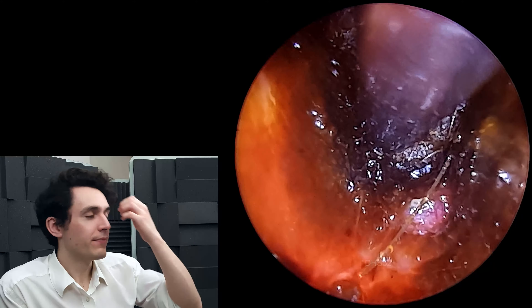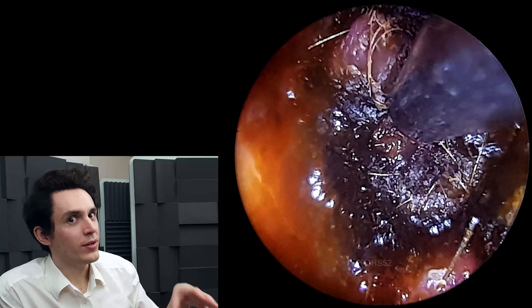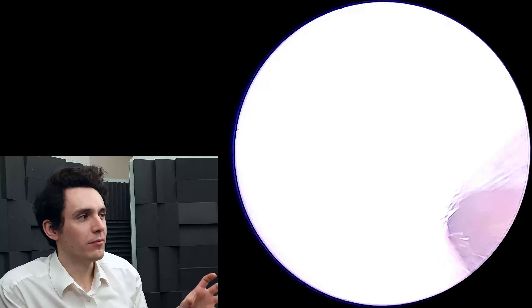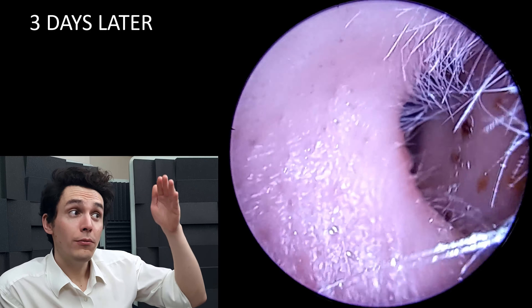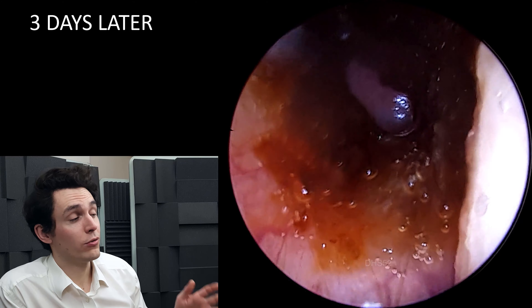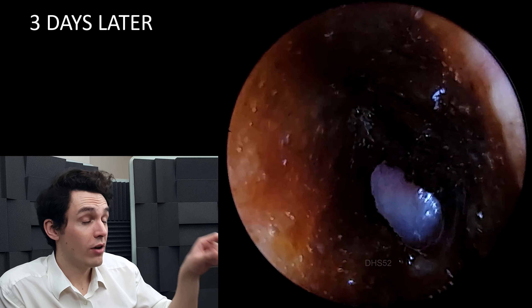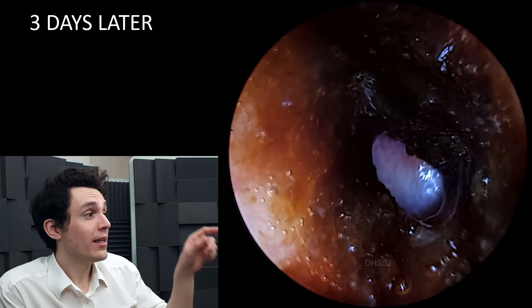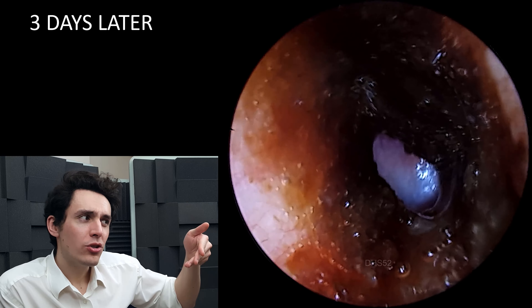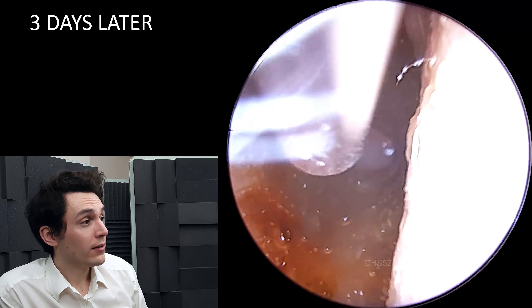So right there is where I think it is, and I'm just probing very, very gently. At this particular point the patient was finding my probing and poking just a little bit uncomfortable. Now, three days after copious amounts of olive oil — according to the patient — here we see a window through to the eardrum. Right where that white arrow was, that is the eardrum. That sort of bluish, shiny, pinkish skin back there is the window.